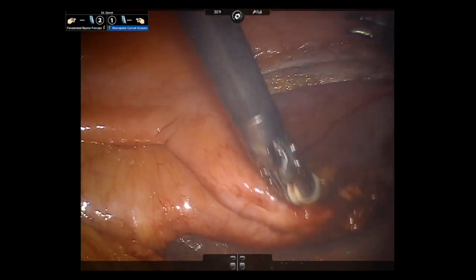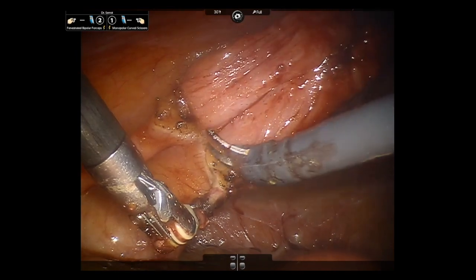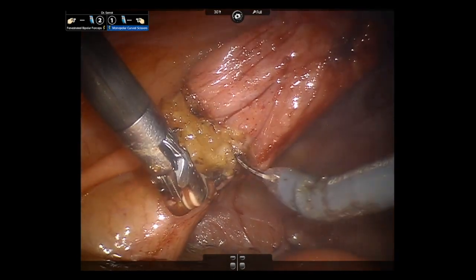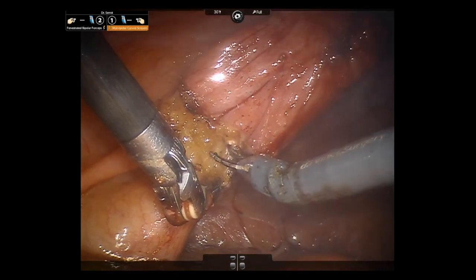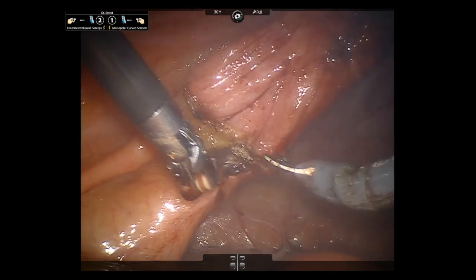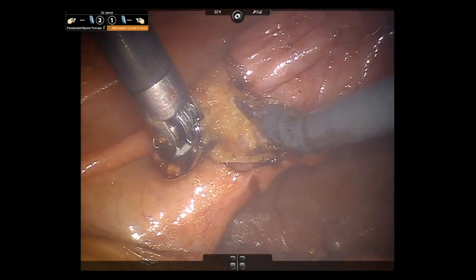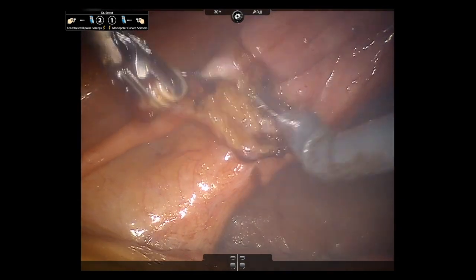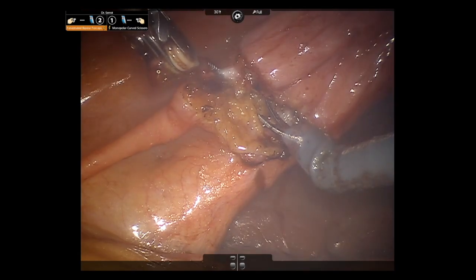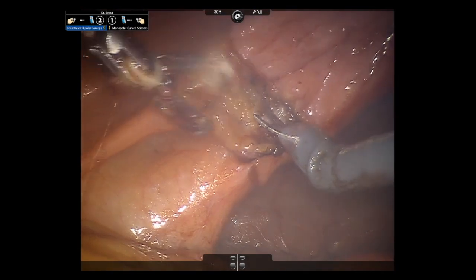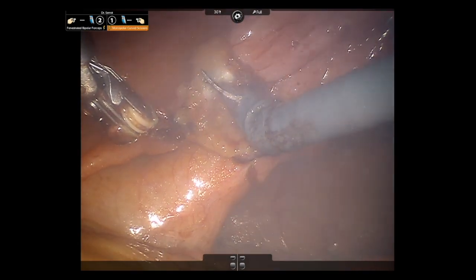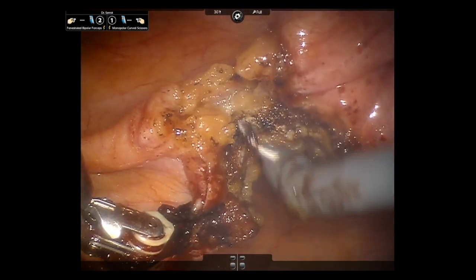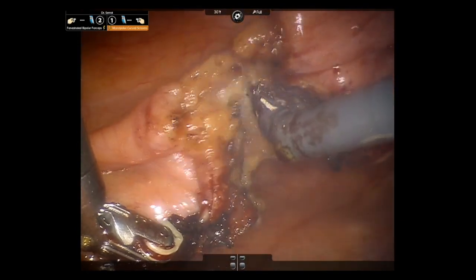Dissection was then carried down along the peritoneum between the anterior abdominal wall and the median umbilical ligament until a soft plane was noted between the urachal cyst and the bladder. Careful dissection was used to free the urachal cyst from the bladder, achieving hemostasis and ensuring that no injury to the bladder was incurred. The median umbilical ligament was isolated just above the level of the bladder and was dissected free prior to ligating with bipolar cautery and scissors. The dissection of the urachal cyst was then completed by removing the remaining tissue connecting it to the abdominal wall.